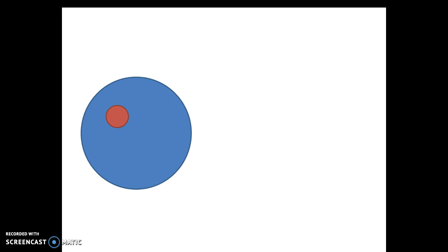We have learned in Chapter 3, Image Reconstruction, that back projection is the mathematical process primarily responsible for CT image reconstruction. During this reconstruction method, the ray sum data acquired from each projection is projected back onto a matrix.